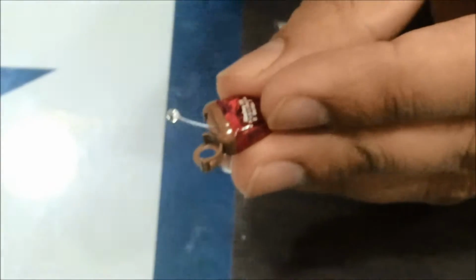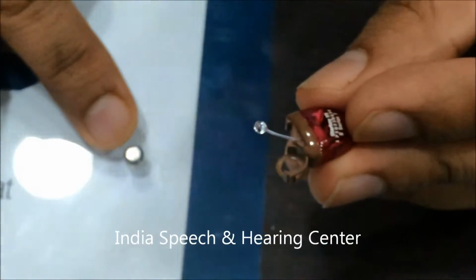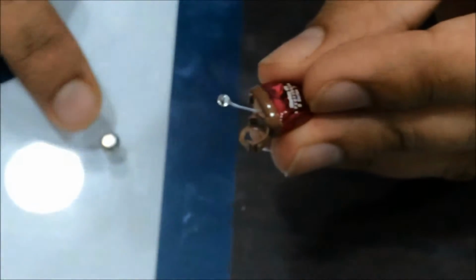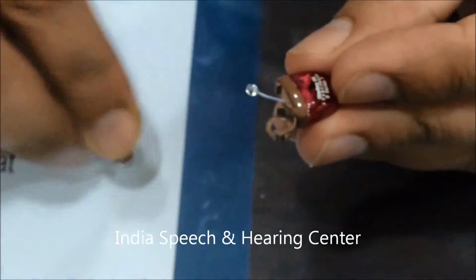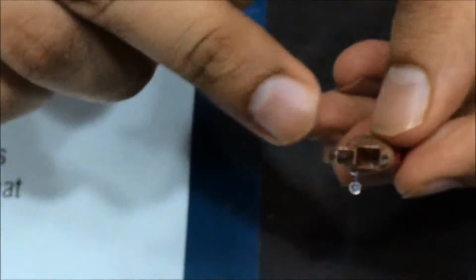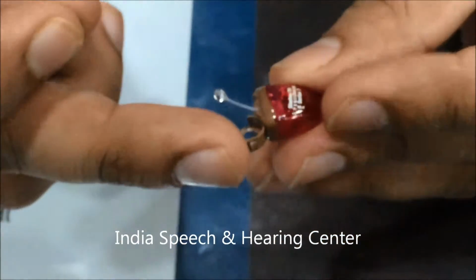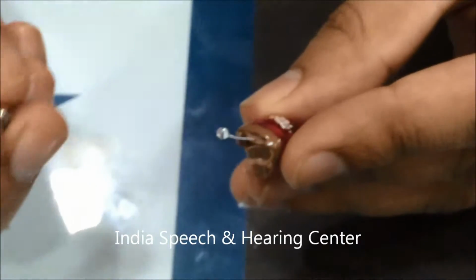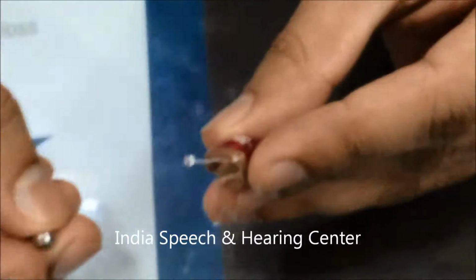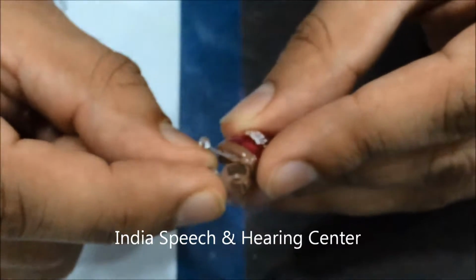The CIC hearing aid typically uses a 10 size battery, which is the smallest battery that we have for hearing aids. This battery, like other hearing aid batteries, has got two ends. One is the button, the other end is the flat. The button end would be fixed towards the semicircular portion of the battery door, whereas the flat end will remain on the open end. There is an opening to the semicircle, and battery would be inserted through a sideward direction inside the battery door.